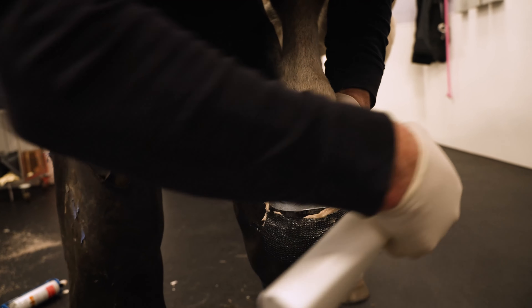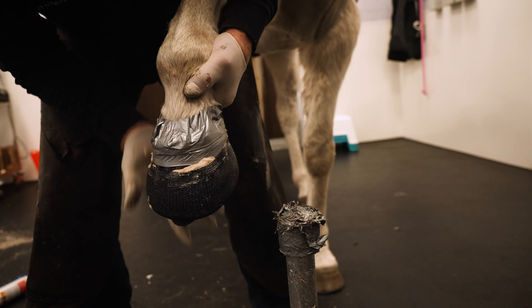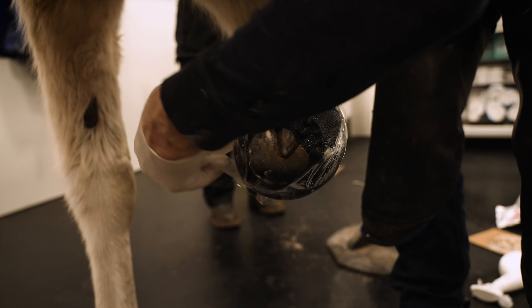Next, dampen the cast with a spray bottle or damp sponge — this will activate the cast. Once the Mustad HoofCast has been activated, wrap the hoof in cling wrap.